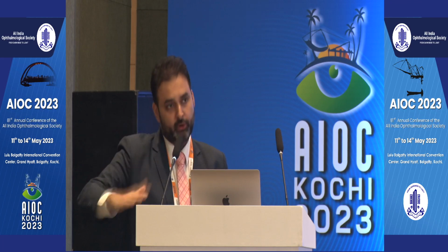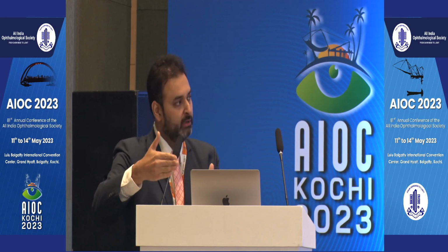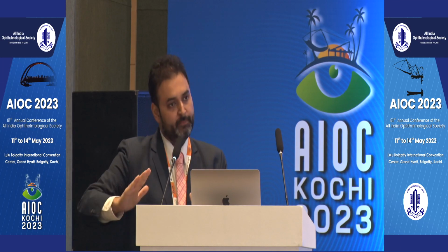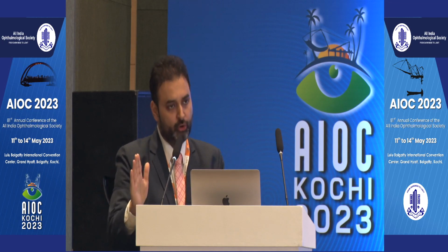I think one important point to look at is, as he rightly did in the first patient, if the eye is open because it was a bigger limbal wound since he was planning SFIOL, at that point in time it's prudent to shut shop, suture the eye, and then come back to fight another day. Whether you want to leave the patient on air or fluid is your call.